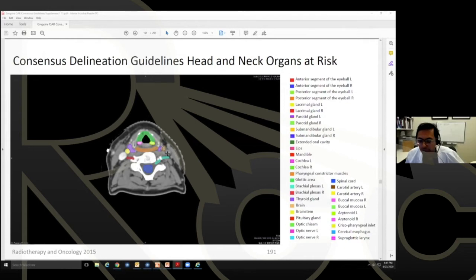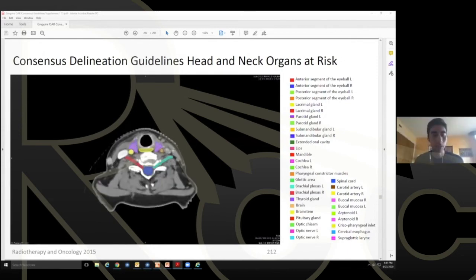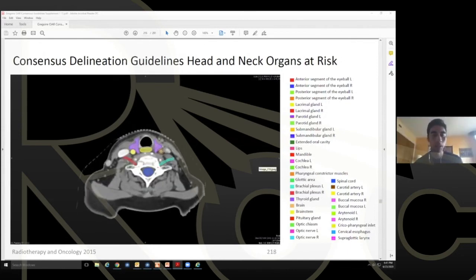Now, especially if these are high risk or intermediate risk CTVs. And Dr. Patel, when you've had those cases where you've had to cover lymph nodes with a high dose, have you been able to correlate that with any long-term toxicities of patients complaining about arm weakness or loss of sensation?